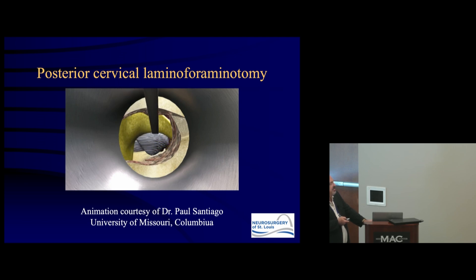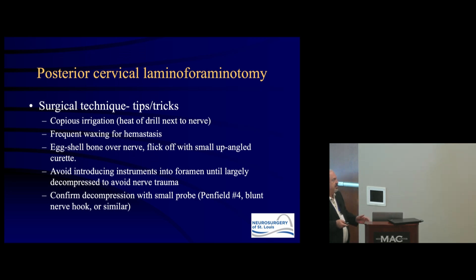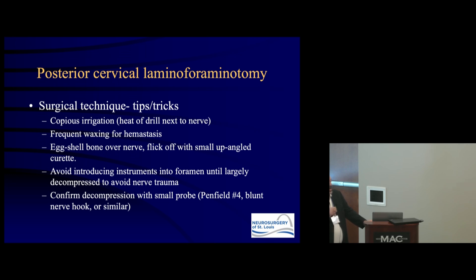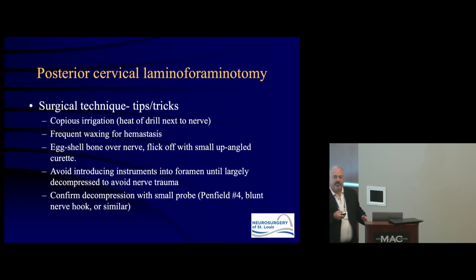Tips and tricks: use copious irrigation throughout — the diamond burr and any drill generate a lot of heat right next to the nerve, so keep it cooled. This area bleeds quite a bit, so periodically apply bone wax to your edges to dry it up. I typically eggshell the superior facet over the nerve — try not to go completely through the cortical shell with the drill — then come under it with a small up-angled curette and flick off the last piece of bone. Don't introduce instruments into the foramen until decompression is fairly complete, to avoid nerve trauma.